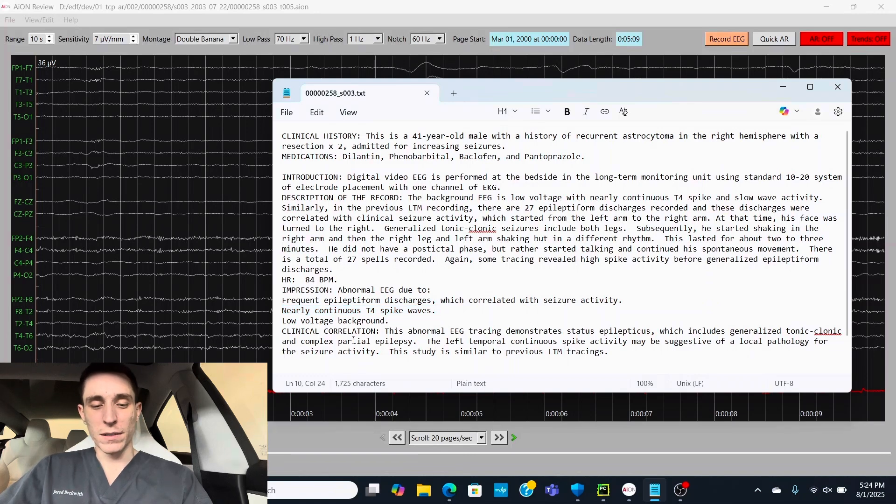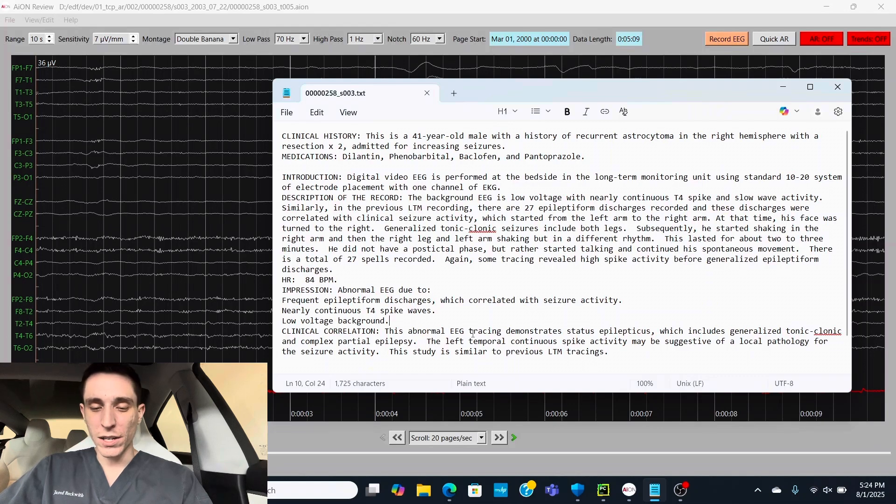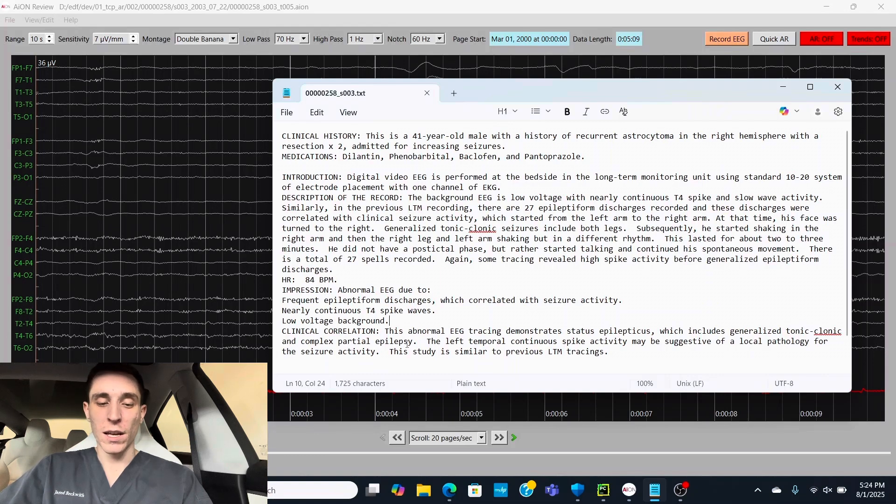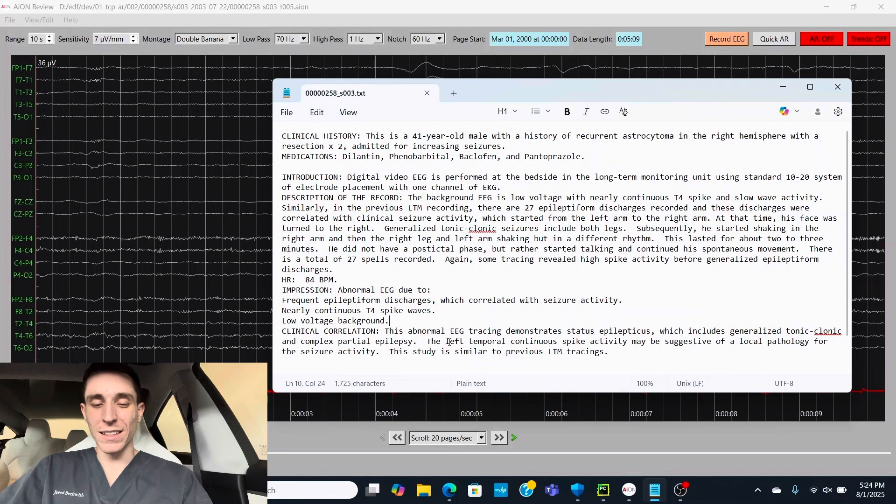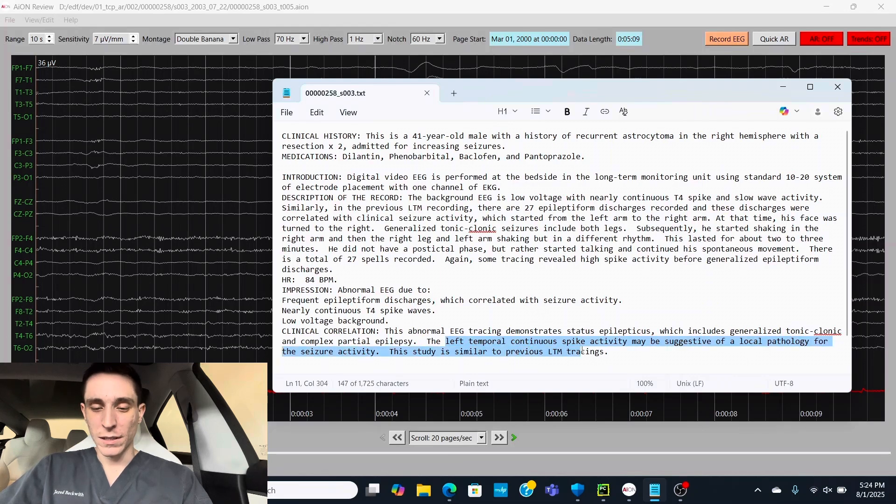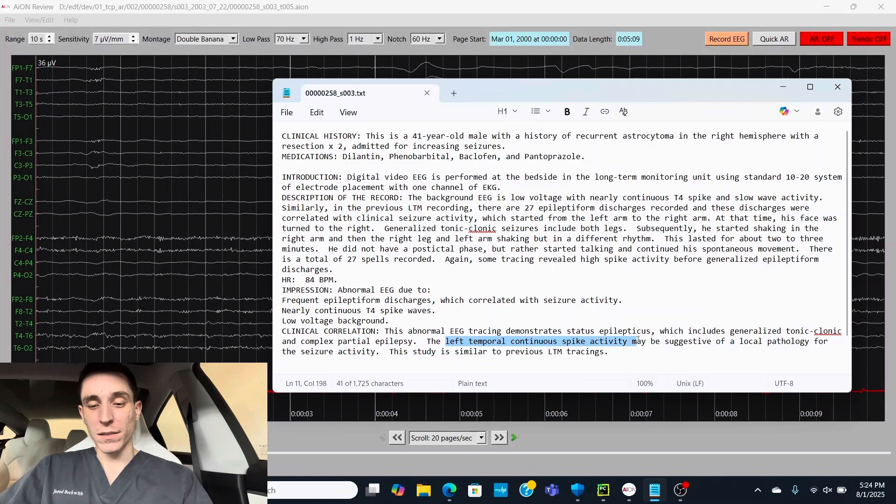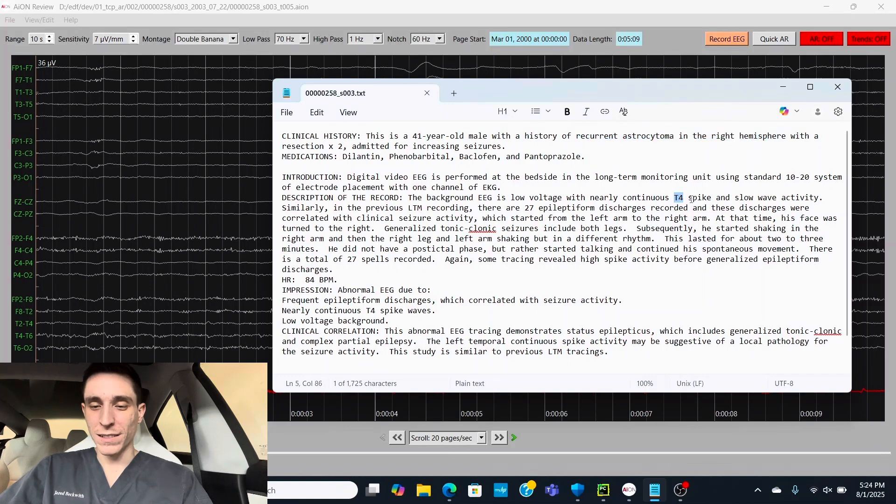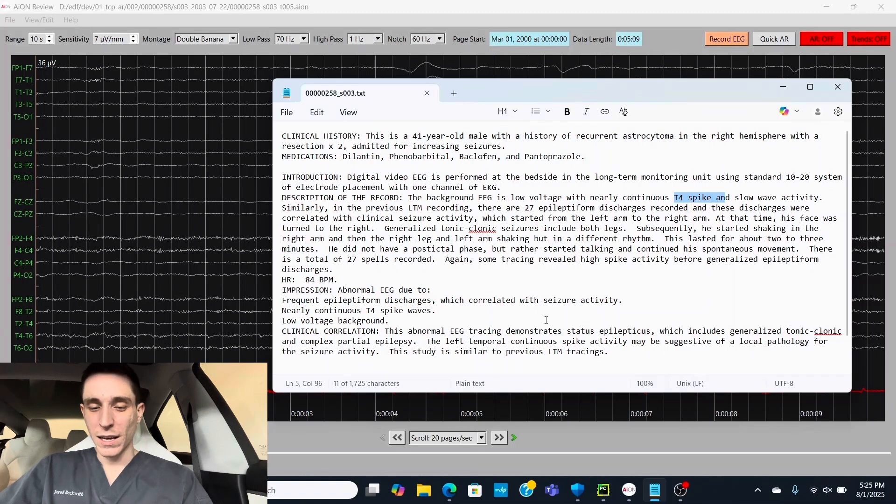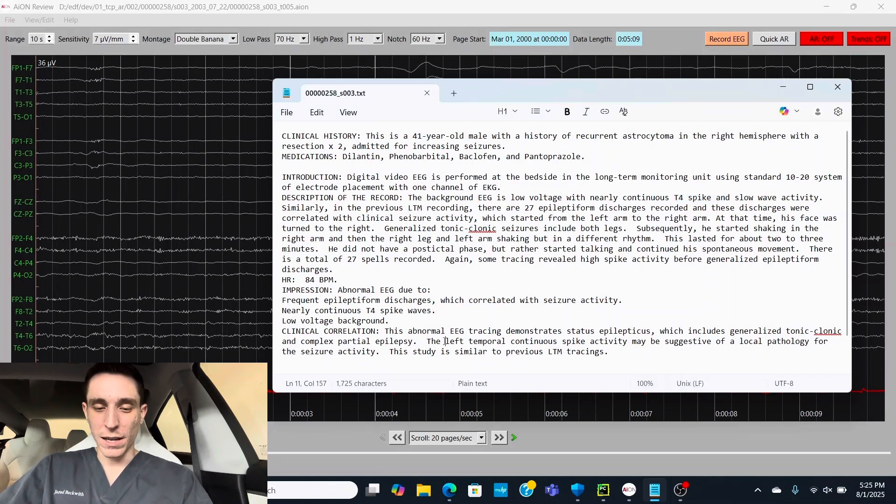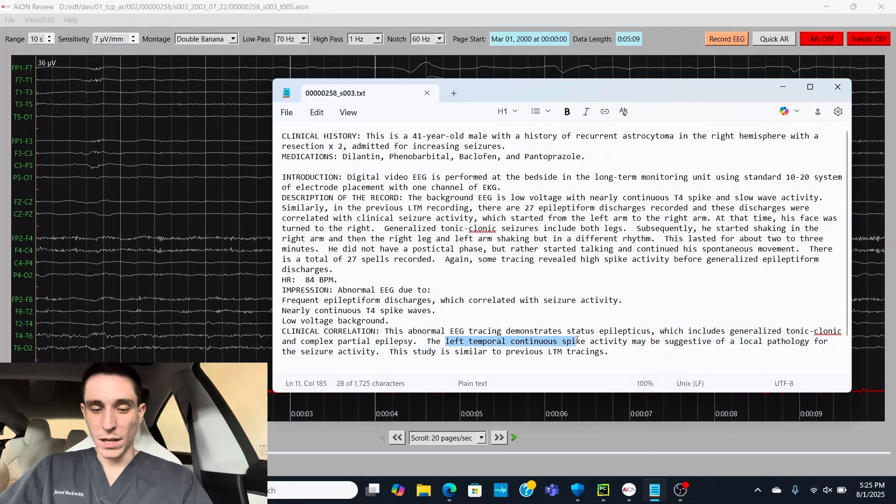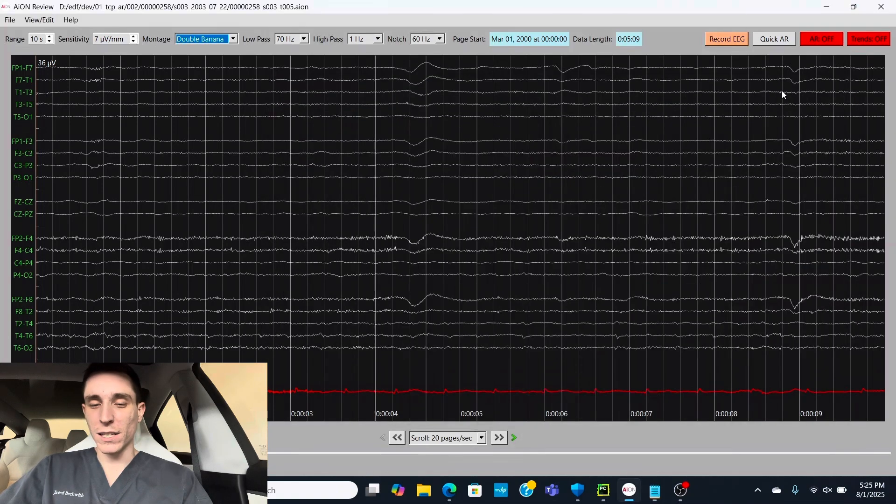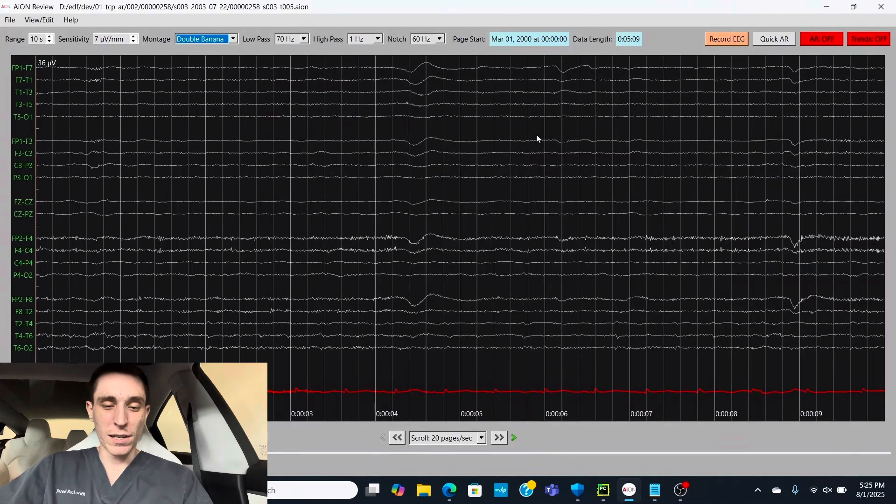But I found a mistake in the clinical correlation. It says demonstrates status epilepticus, which includes generalized tonic-clonic and complex partial epilepsy. All good for now. But it says the left temporal continuous spike wave activity. But we know from the tumor location in the right hemisphere and its T4 spike wave discharges right hemisphere, it looks like the doctor just made a typo putting left temporal. So let's go through and check out the EEG for ourselves.